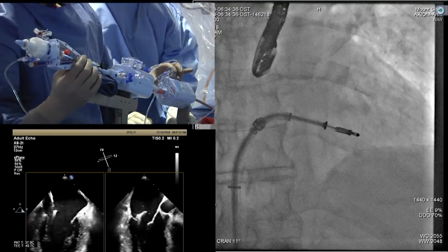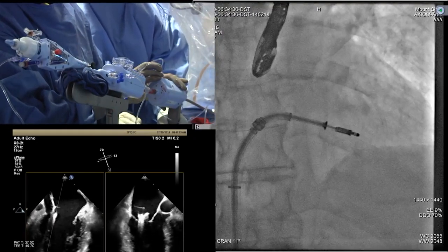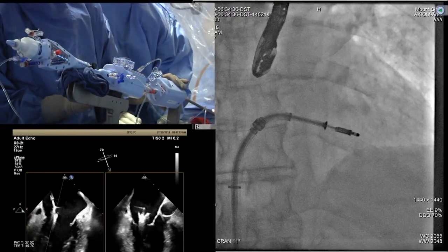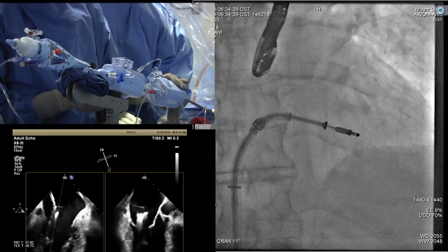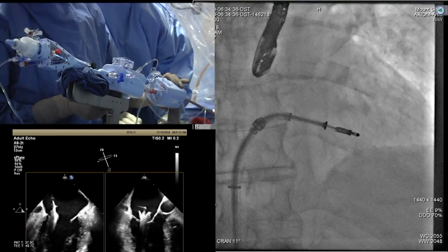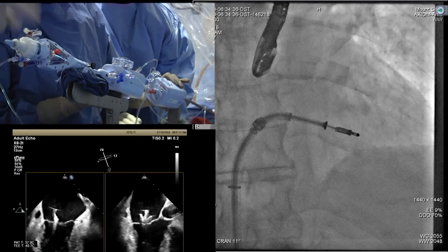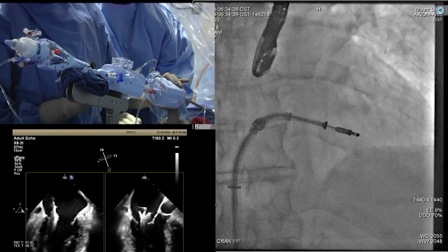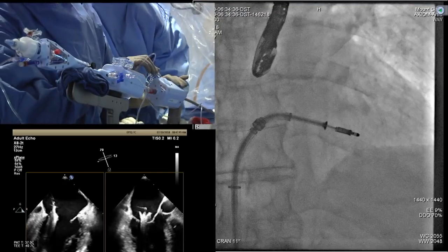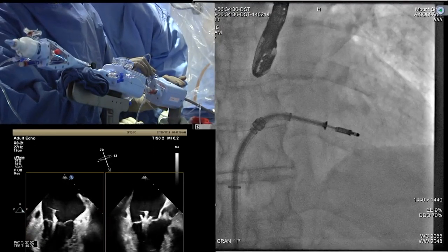You moved a lot medial. So when you give it a little bit of a plus, you're getting a little bit posterior. And you can correct for the anterior position. I like it more. So better? I took a little bit of medial off. Yeah. Plus and anterior. That's what we are doing, right? We are going medial. Yeah, good. And then pull back the clip. Push in.